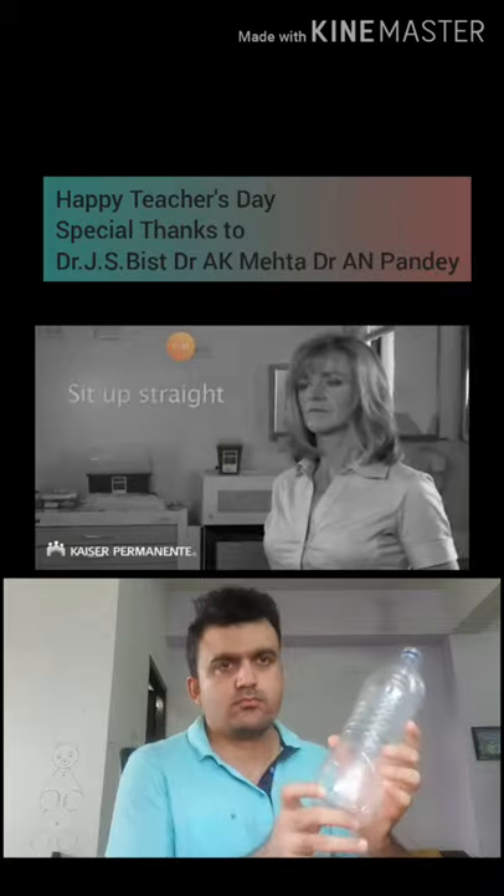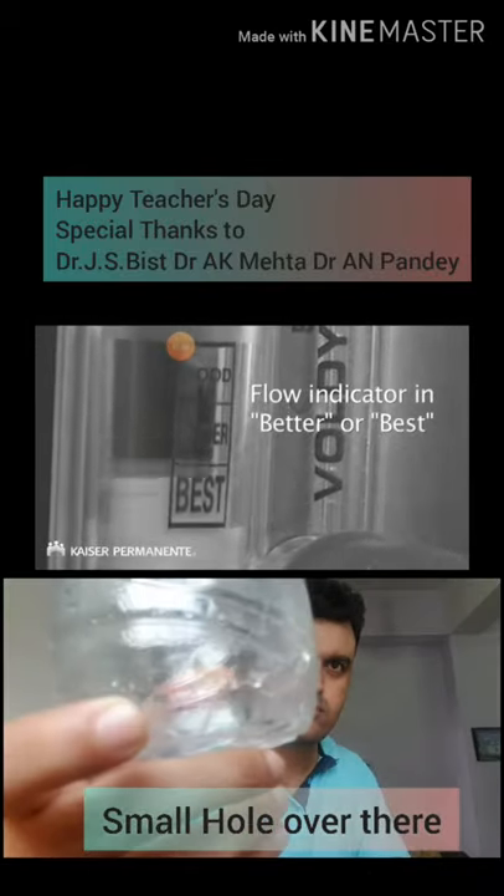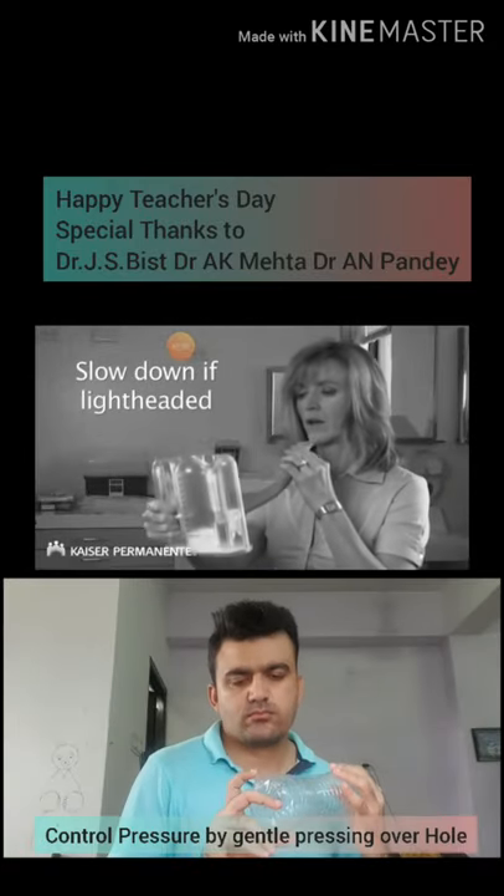Always remember to sit up straight, inhale slowly and deeply, keep the flow indicator in the better or best position, and slow down if you feel lightheaded.